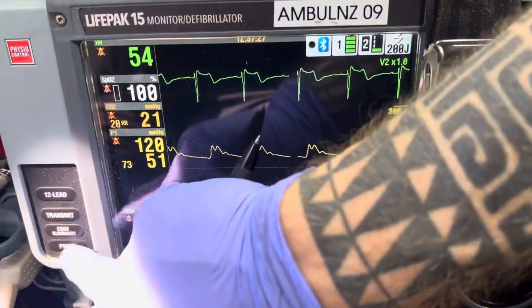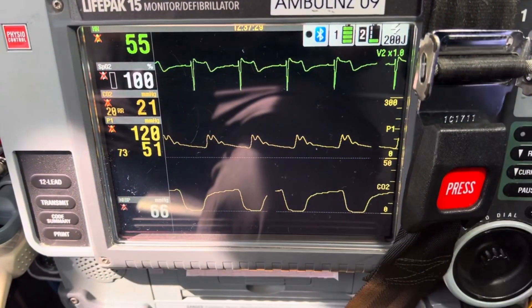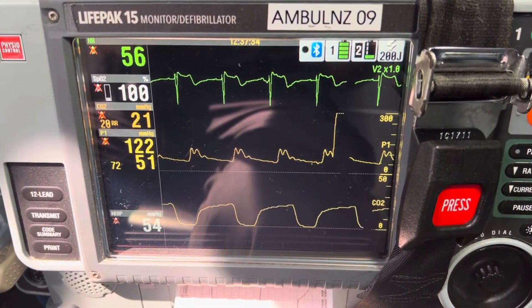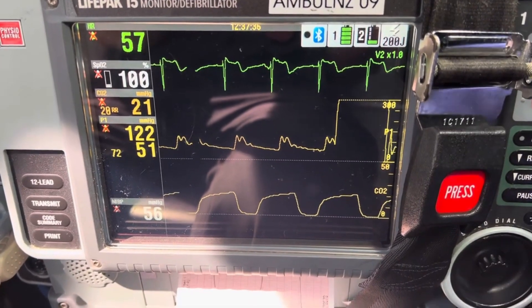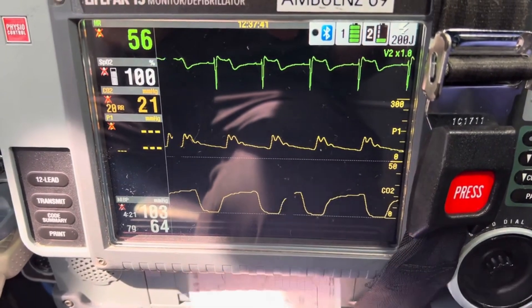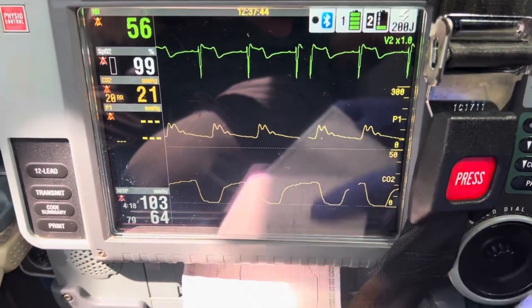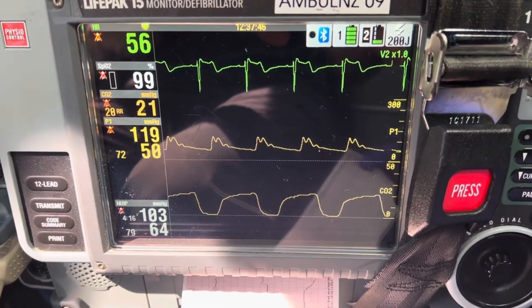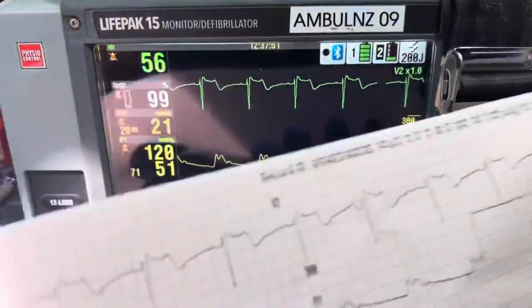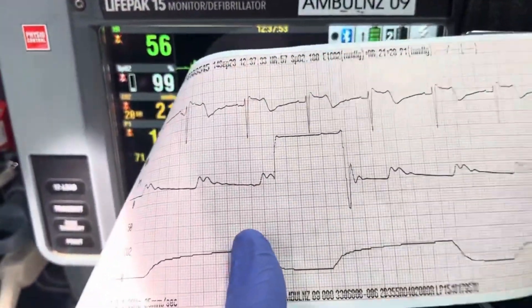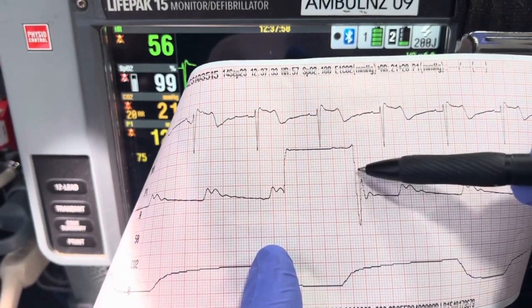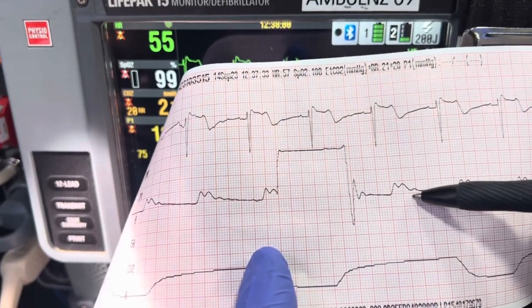What I usually do is click print and then come to the patient. Right here was the fast flush test, and as we're printing it, we can see when we hit it. Now it came out — I'll click stop. Focus on this line right here: we performed the fast flush test and you only see two oscillations right here. So we are properly damped.